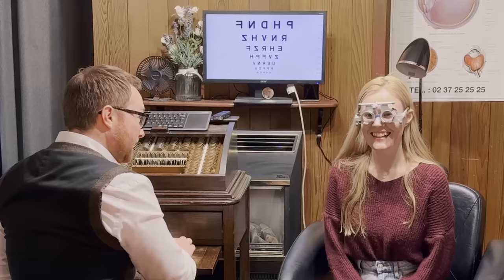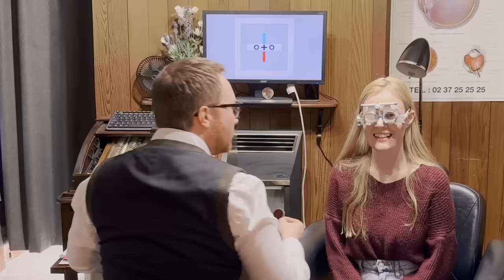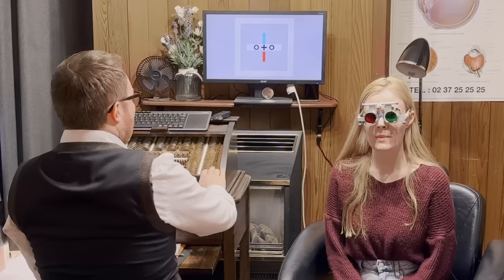Right. Now, the next thing that we're going to do is I'm going to get a funny chart up and put some coloured lenses in. So it's going to feel like old school 3D cinema. So what we're going to be doing is having a look at how well your brain fuses the two images together. Have a few blinks. Now you should be able to see an O plus O in the centre of the screen, and then there should be a coloured block above and below the plus. Can you see those? Yeah.